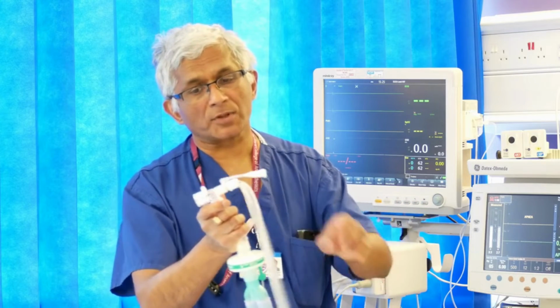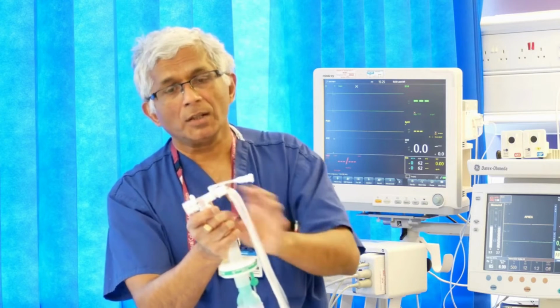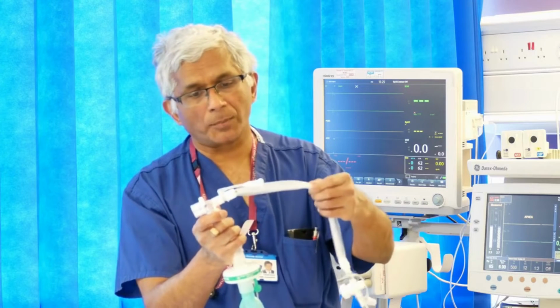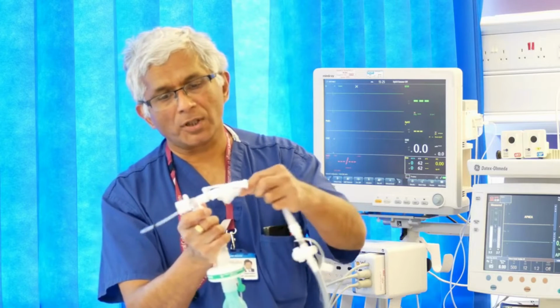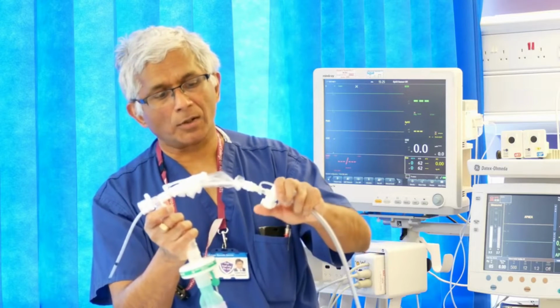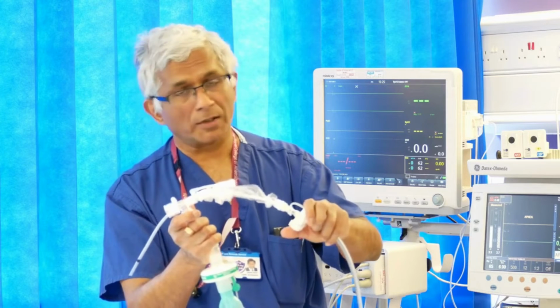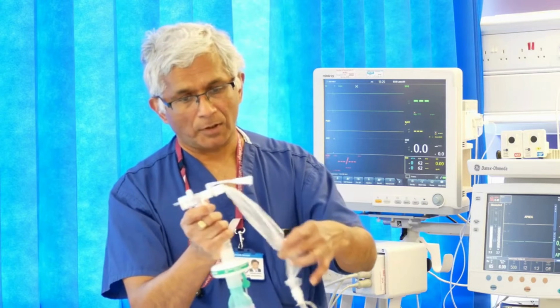If you see a lot of secretions, most of the time the nurse will be doing this. But if the nurse is busy, when you're wearing the protective gowns and protective material, you can help with the suctioning by pushing it in and pressing on this button. Again, when you're doing that, there's no risk of infection. It's a closed circuit.